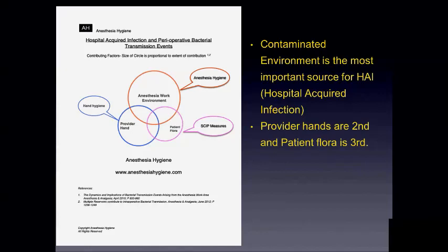When it was one isolated study, it was not really picked up. But then several studies proved it. And remember, all these studies were done when the anesthesia machine underwent what is known as routine cleaning as per existing protocol. It was not done to prove a point by not cleaning the machines. In all these studies, they educated the technicians to clean the machine, and the technicians and everybody knew that the machines were being cultured. So all these studies indicated that.